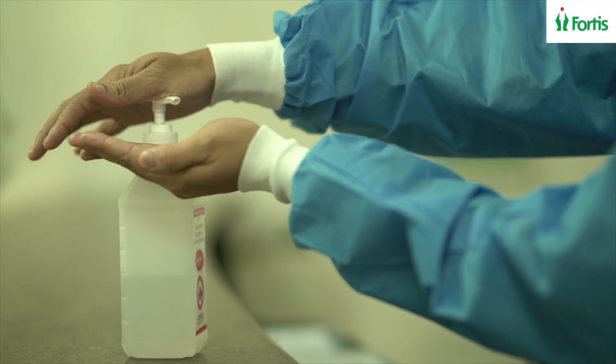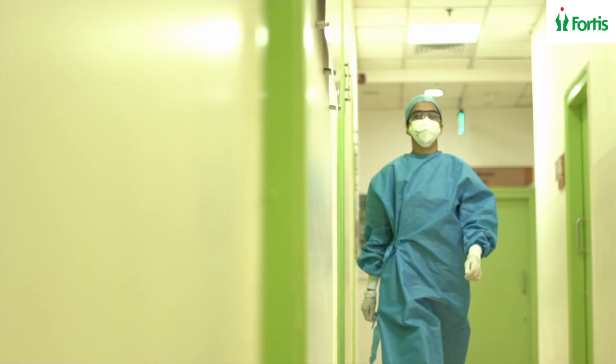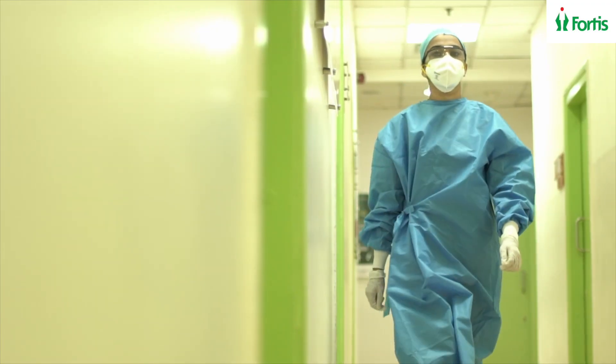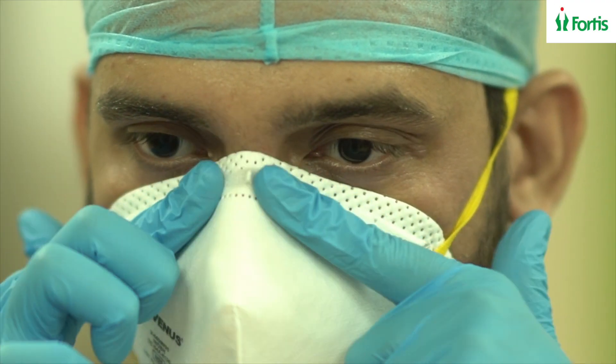The COVID-19 epidemic has underlined the importance of having an adequate supply of appropriate personal protective equipment and N95 masks available for our healthcare workers. Based on the shortage that has been experienced globally, the CDC and the WHO have come up with recommendations for extended use of N95 masks.